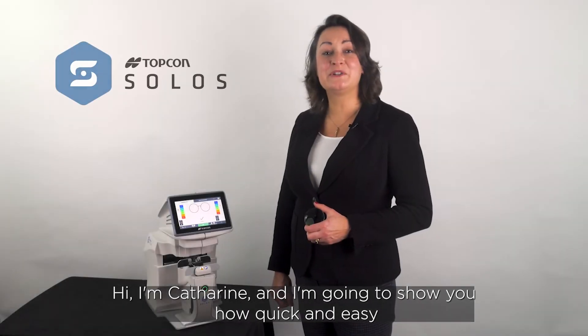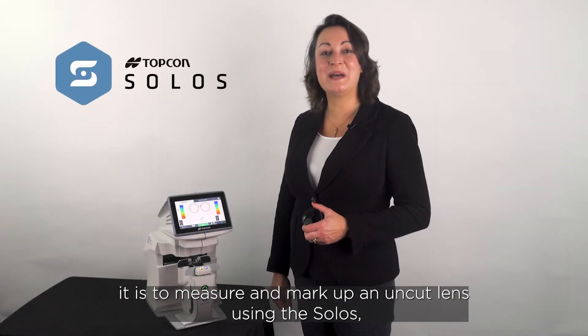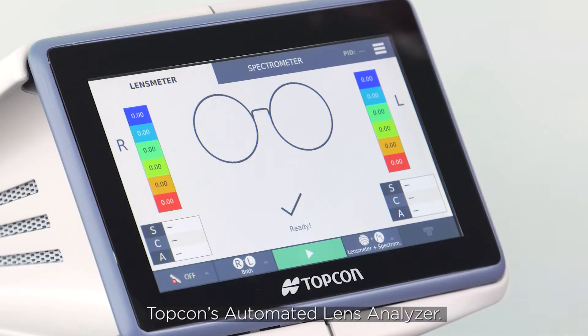Hi, I'm Catherine and I'm going to show you how quick and easy it is to measure and mark up an uncut lens using the Solos, Topcon's automated lens analyzer.